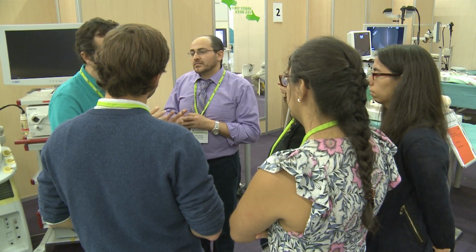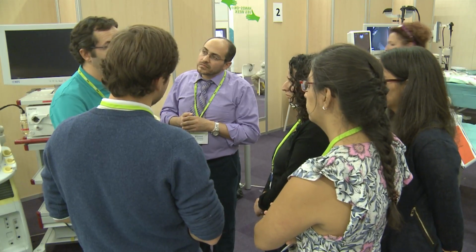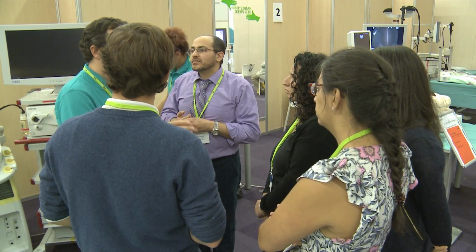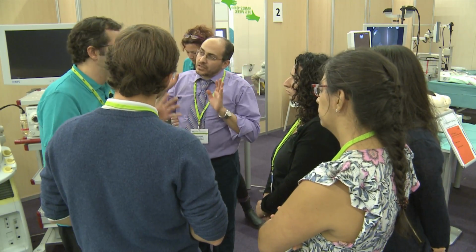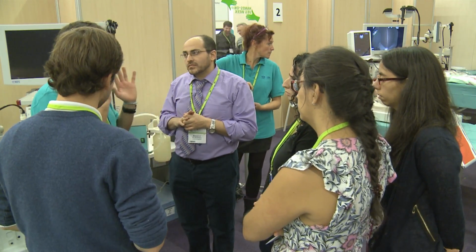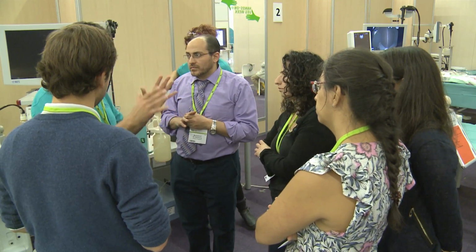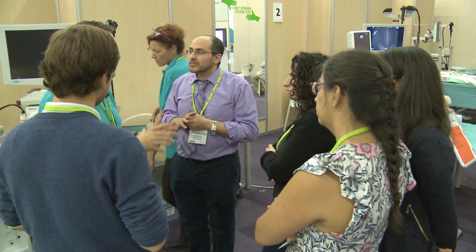The other thing is when you have a patient with a history of renal cancer, colon cancer, or lymphoma, and then in the follow-up you find that lesion. That's different, a complete workup. In that case, you need to rule out metastatic disease. So what do you do for these lesions? The ProCore? It depends. I see the lesion, I do nothing at the very beginning. I speak to the doctor who sent me the patient, I explain the findings, and I make a workup. Okay, this is a previous lymphoma patient with this new finding.